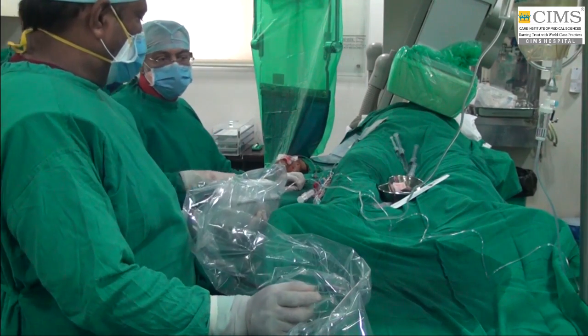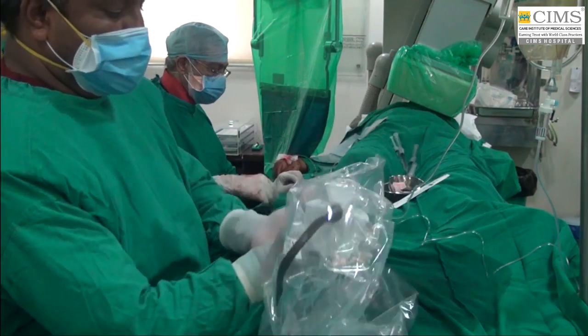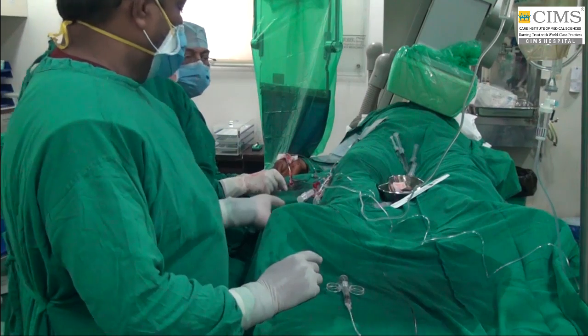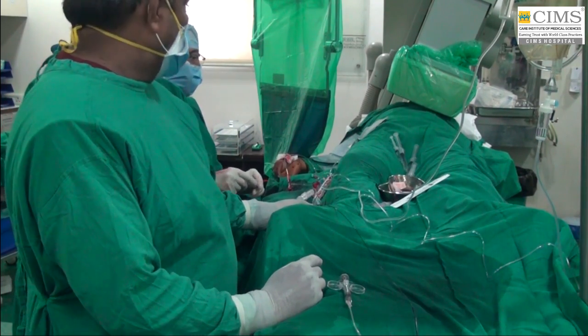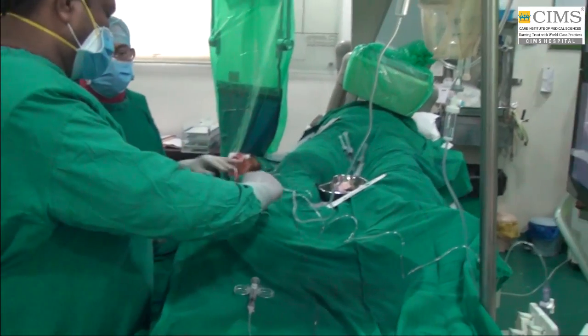We also see and evaluate the stent expansion, stent apposition, luminal area, as well as proximal edge dissection. We will also see if there is anything else intra-stent, like any residual thrombus, any prolapsing tissue.